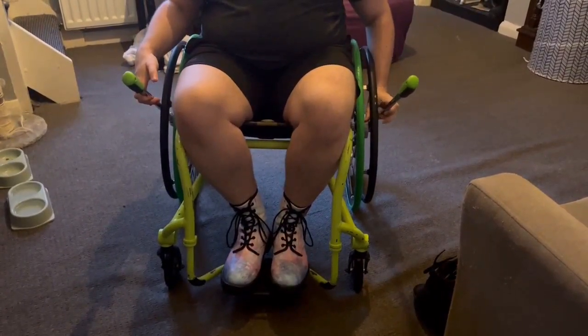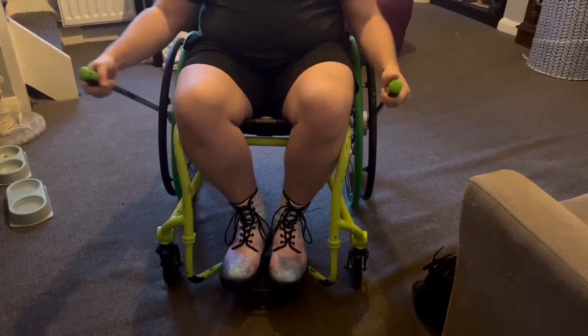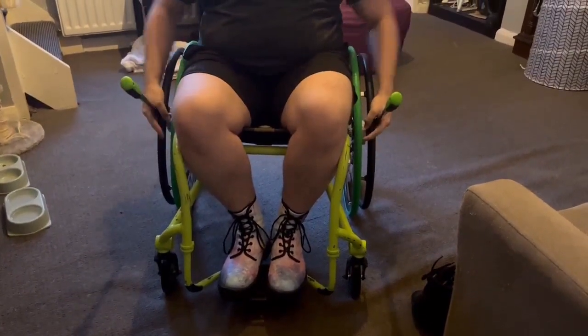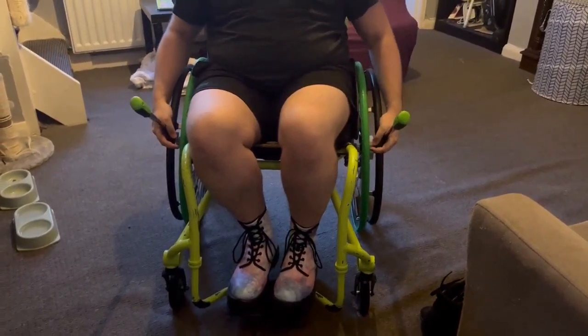I have rubber push rims. So I can just push my metal into the rubber push rims and that stops it. It can also stop like this — a little bit with your hands and the poles.